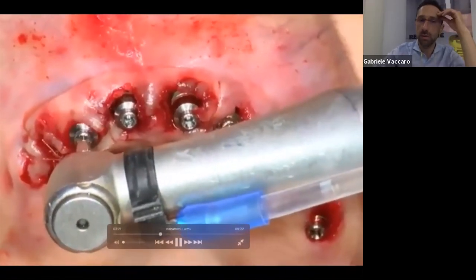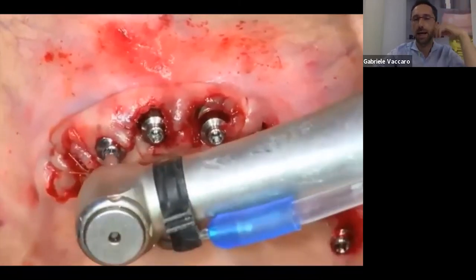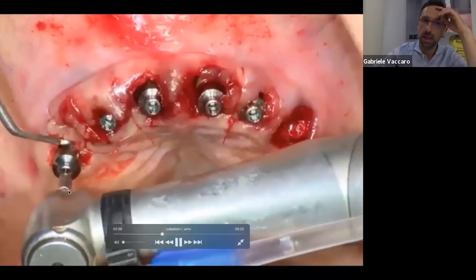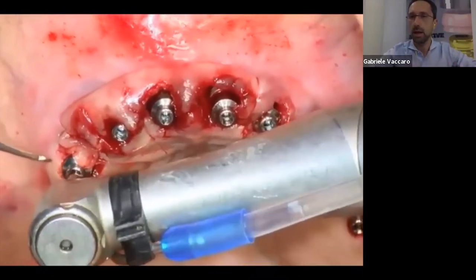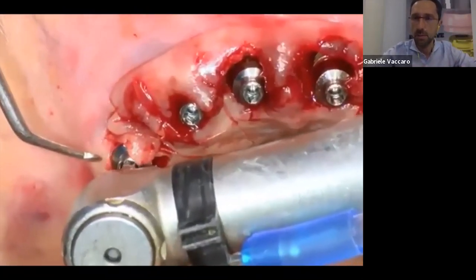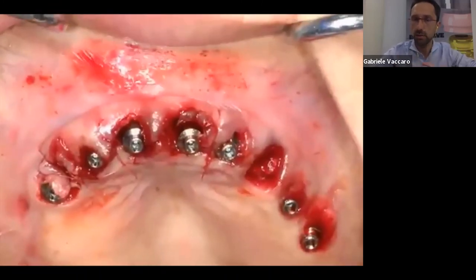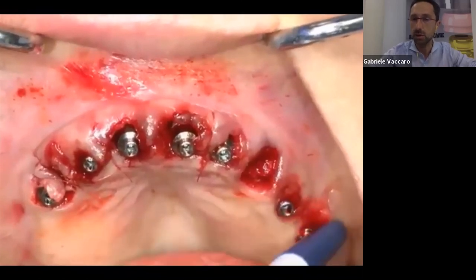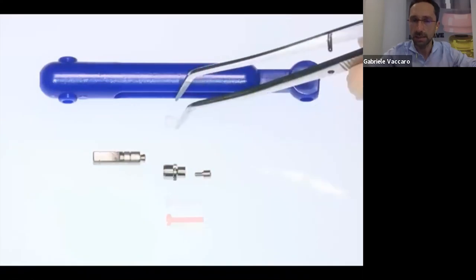We can screw the equator, as you saw, by hand. The first was screwed by hand, or with the hand piece, the implant driver. So with the implant driver, we can check the torque we are screwing the equator. Someone asked in the beginning, which is the torque? You can set the torque with your implant driver at the recommended torque by the implant company.